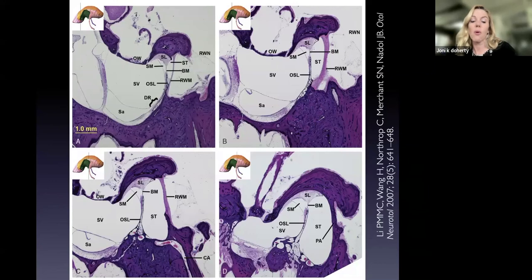And I think that's probably the reason behind our initial thought that the cochleostomy was the better way to insert a cochlear implant electrode, because for many years that was the way it was done, even with hearing preservation surgery attempts with short electrodes. And it was hotly debated. I think a lot of you probably remember that. And now pretty much everybody goes for the round window insertion.